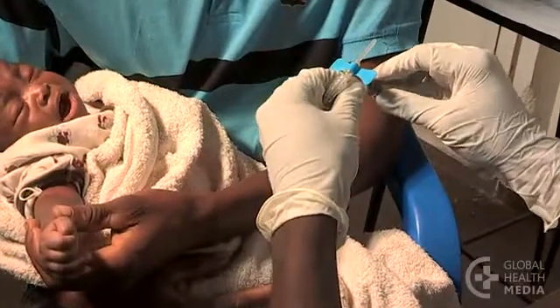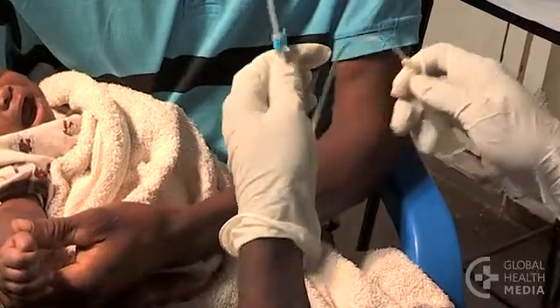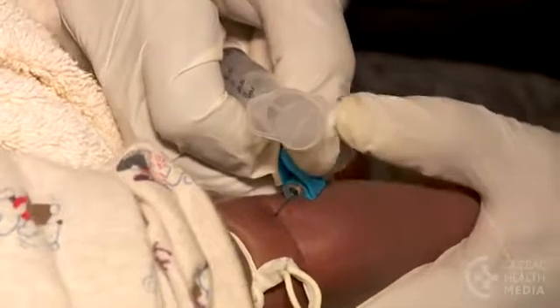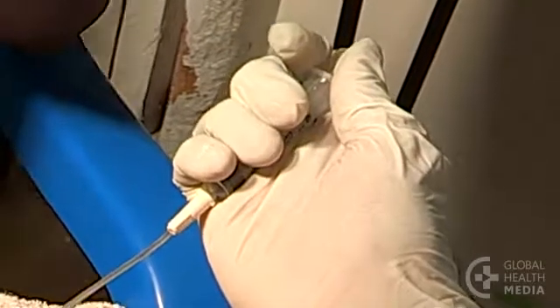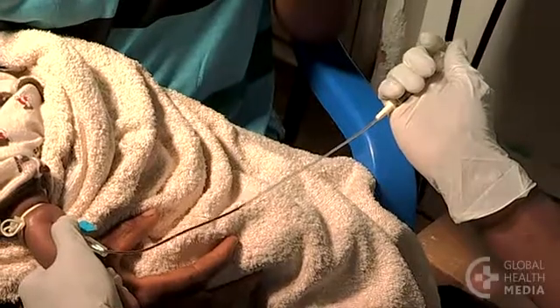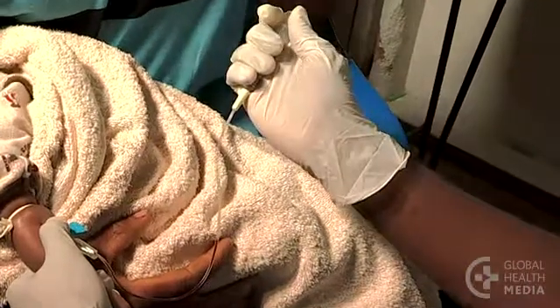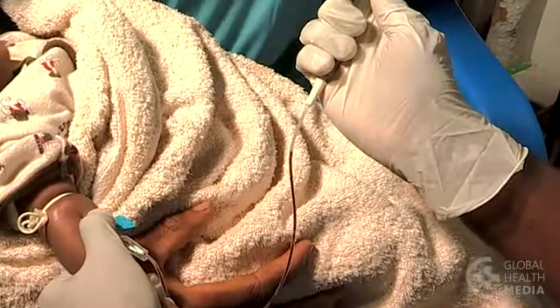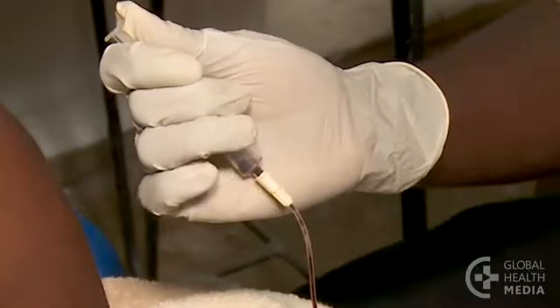In this second example, a syringe is attached to the tubing. Pulling up slightly on the syringe draws the blood into the tubing. Be aware, if it fills too slowly, it can clot. Let it fill the syringe until you have the amount of blood you need.